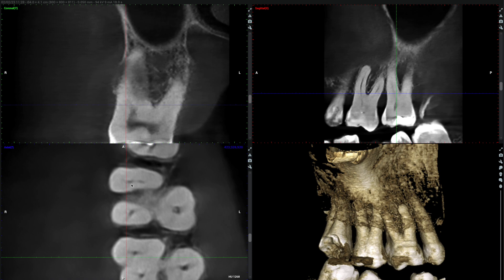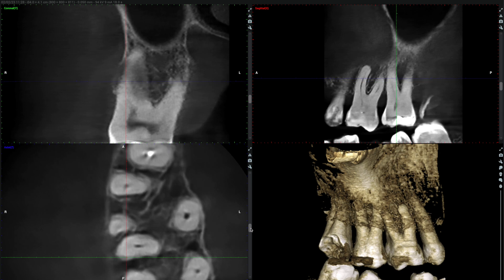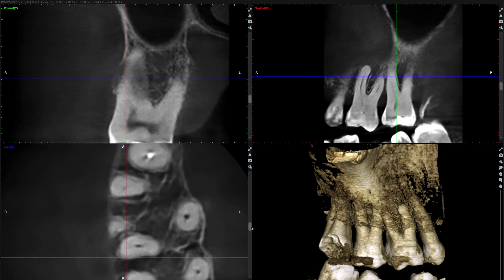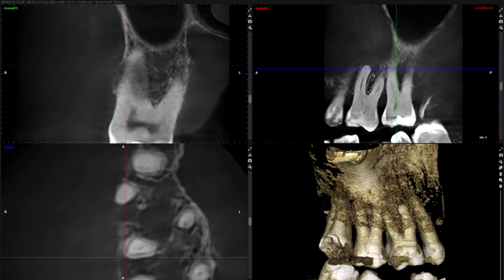Here we are looking at the small volume CBCT of the maxillary right first molar. I'm checking the axial view to start with and as I get to the apex of the MB root I can see a periapical radiolucency. This is also present on the sagittal view.